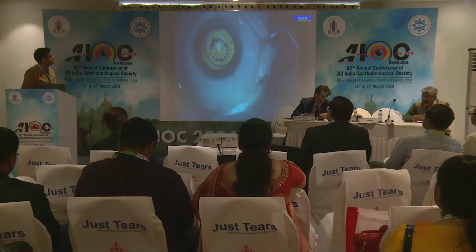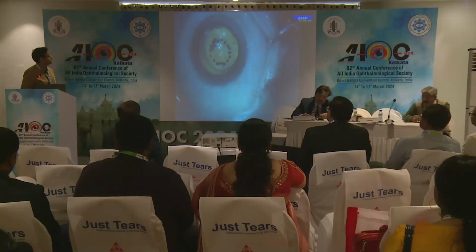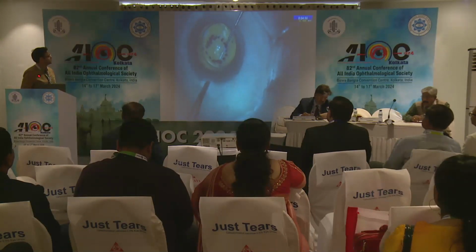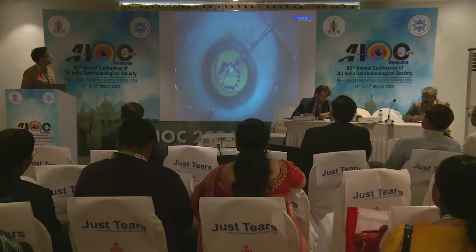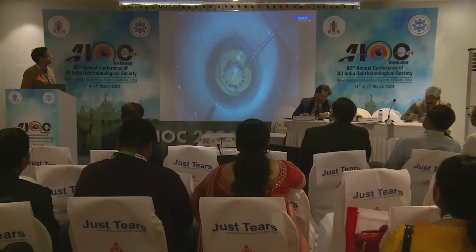So after making the side port incisions, I injected cohesive viscoelastic in the anterior chamber, washing the cornea so that I can see clearly the details where I have to initiate the rhexis. So I've started the rhexis using the reverse Sinskey hook. As you can see, I can get a leaf of Descemet's membrane coming out, and using the ILM peeling forceps to initiate the rhexis.